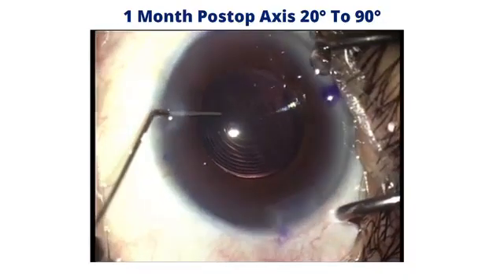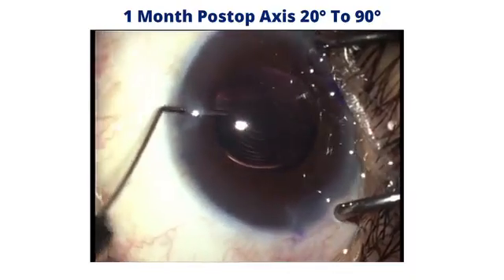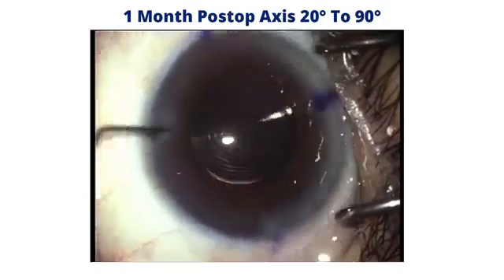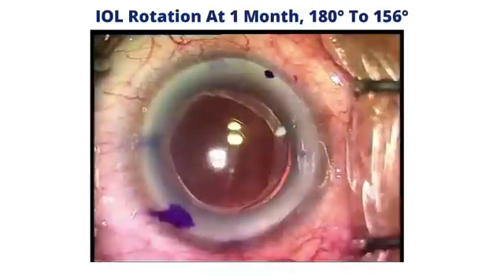It's important to make sure if you put viscoelastic under the intraocular lens that you remove it completely so that this lens does not re-rotate. Tap the lens against the posterior capsule, check the pressure that's not overinflated. Now let's have a look at this second lens.